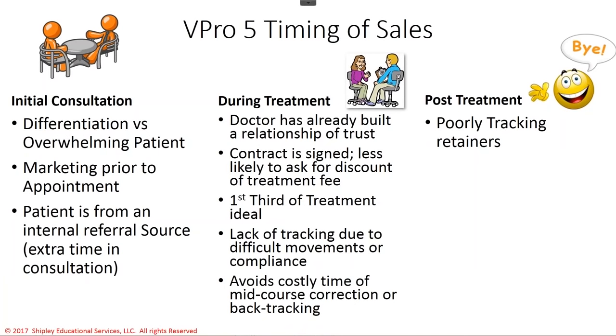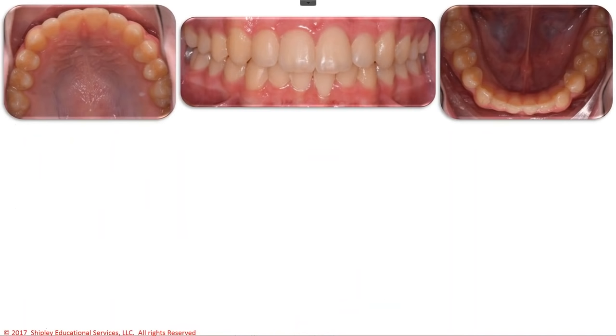I have found that there's also a place for this post-treatment. What about poor tracking retainers? Look at this case. I think that this is a great looking case. I mean, I look at this. This is a great finish for me. This was a traditional treated case.